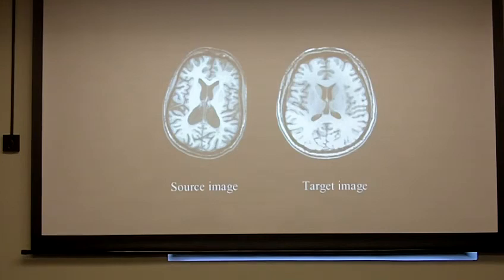Every time you resample the image, every time you actually apply the transformation, you degrade the image a little bit. So if you can calculate both transformations, combine them together, and then apply them all at once, you only degrade the image once. Right. So sticking with one software package is good.